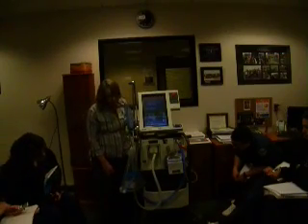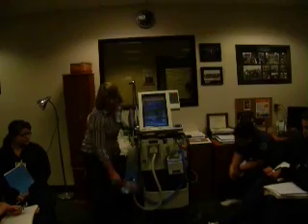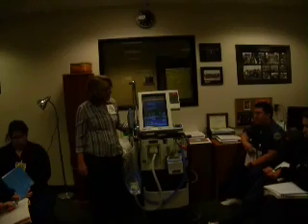What's in that thing? What thing? The big old thing on the bottom. That's the air compressor. Yep, this is the air compressor. Some of these vents you'll see they don't have this here. This will just be a blank space. That means it has no internal air compressor. Other questions?